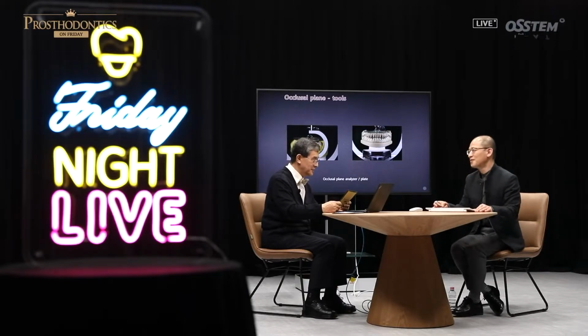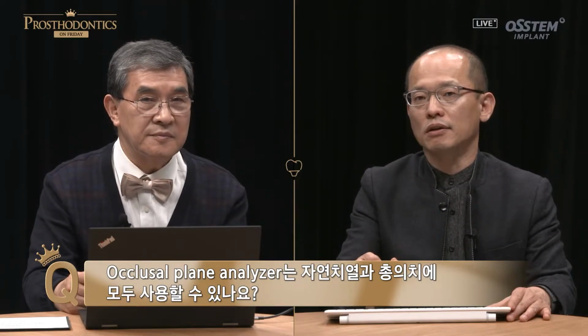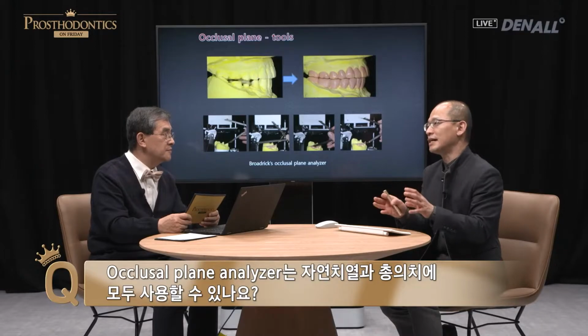Can I ask you a question? Here you use the occlusal plane analyzer. Be it natural teeth or full denture, can you use it for both cases? Yes. I just talked about the occlusal plane analyzer, and that is very much articulator-focused. If it's used with a pen, you can use it. But if you use it as just a tool, then even on the mock-up model there are landmarks, so it's very easy to use.